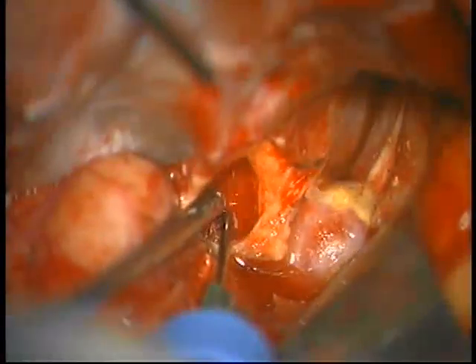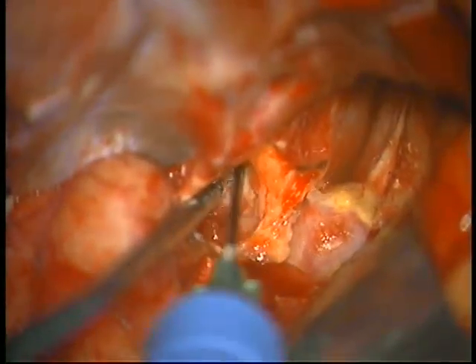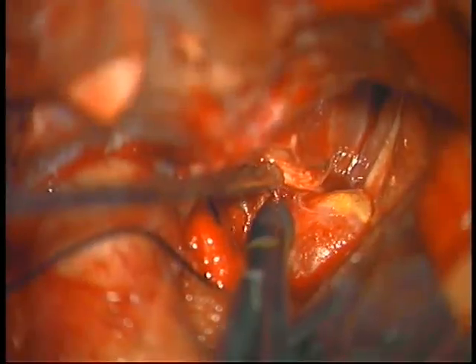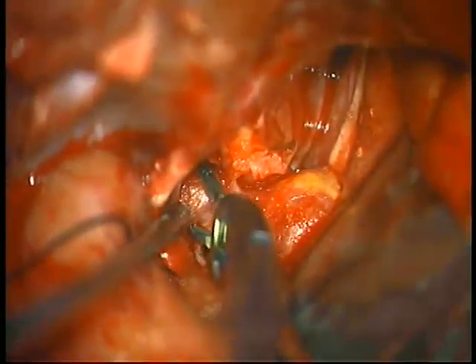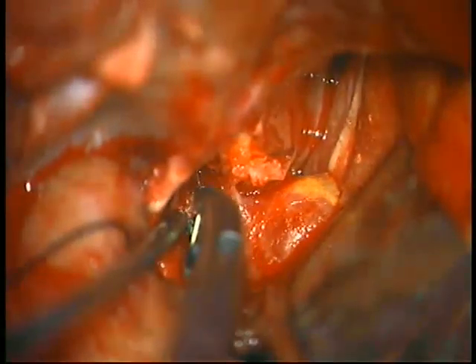We injected fibrin glue to avoid any bleeding coming from the sinus. After, we cut the distal dural ring and the cover of the optic nerve to facilitate its mobilization. A temporary clip is positioned between the proximal and distal dural ring.